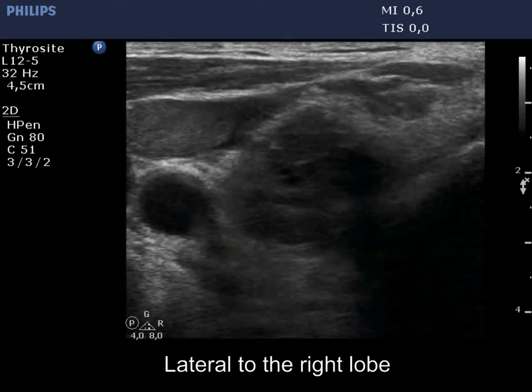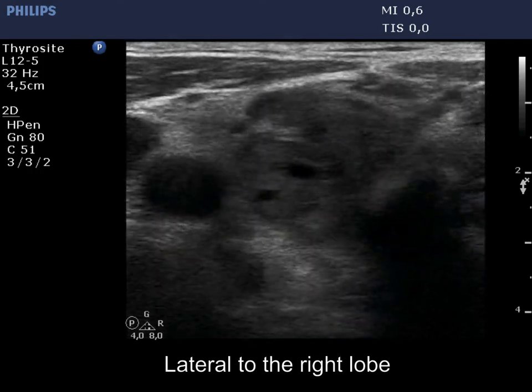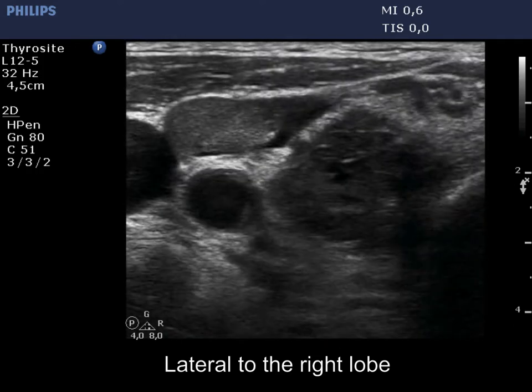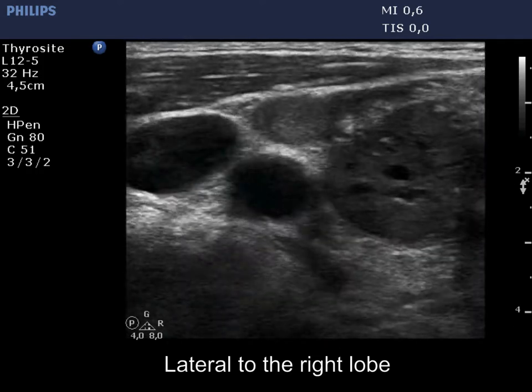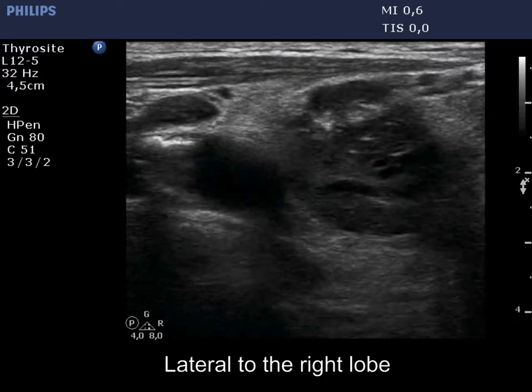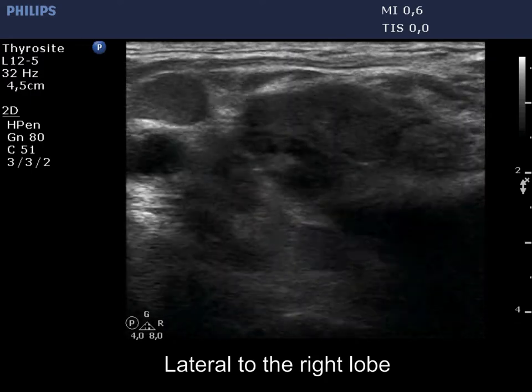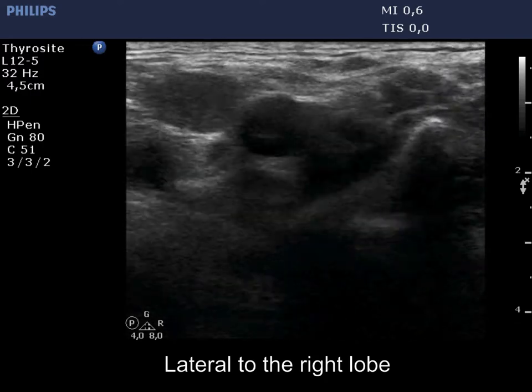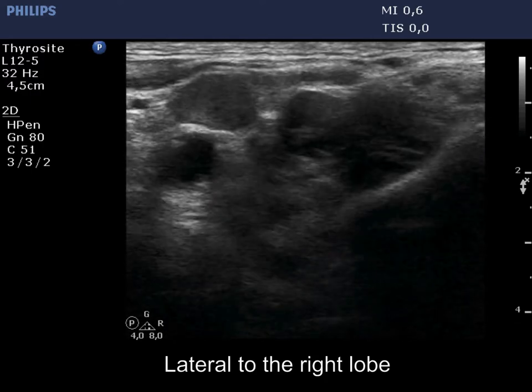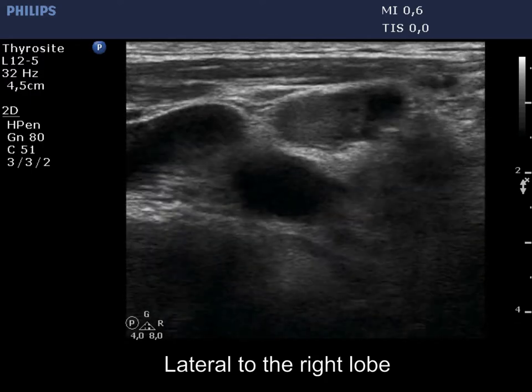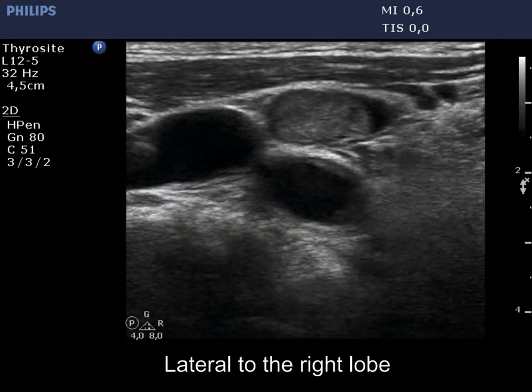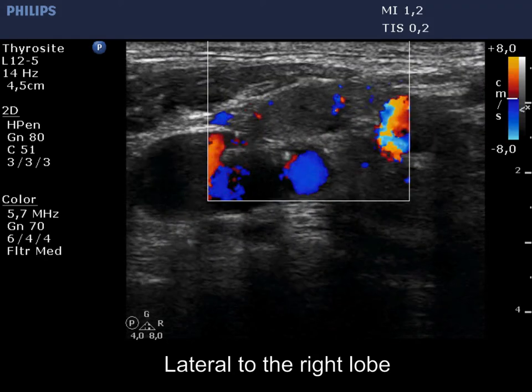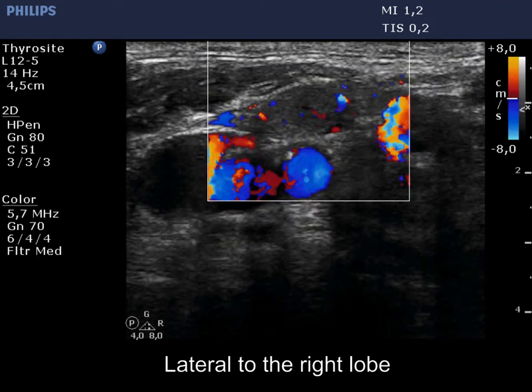There is a metastatic node lateral to the right lobe. The node is heterogeneous, has cystic areas but lacks hilum. The vascularity is abnormal.